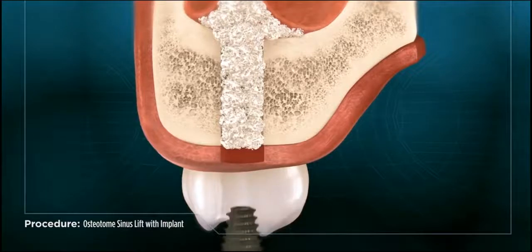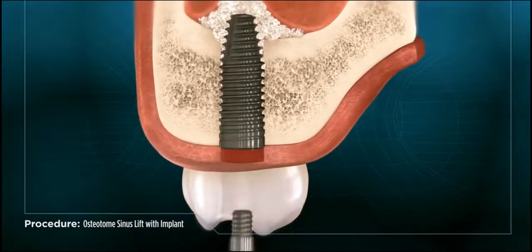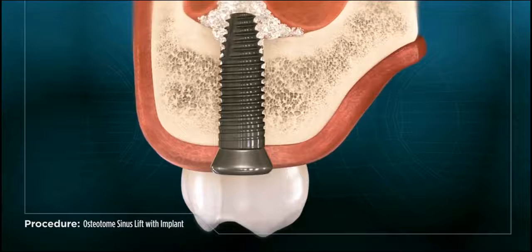Once the bone graft is placed, the implant is placed along with a special healing cap, and the area is allowed to heal.